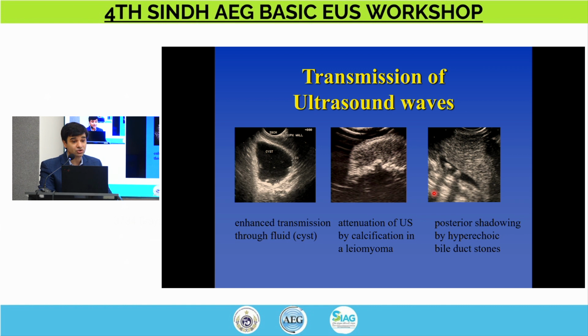This is called an echo shadow, and it tends to be cast by things that are denser than their surrounding medium. And so this is a typical appearance of a stone. The stone looks bright, and yet it casts a dark shadow behind it. This is not something you would see with a soft tissue lesion that may also appear bright, but would not cast that shadow.